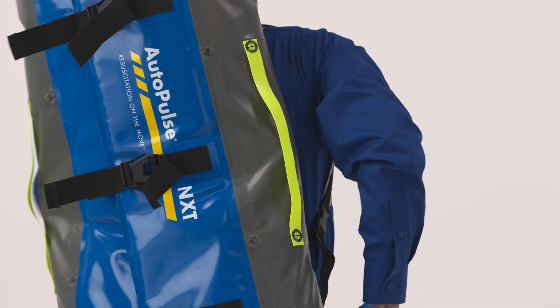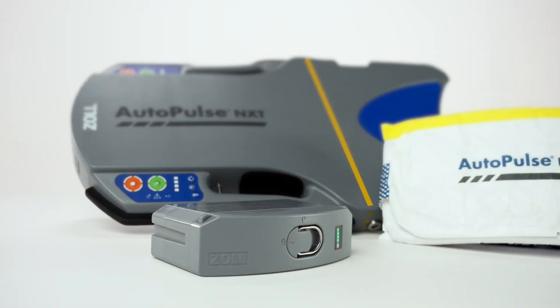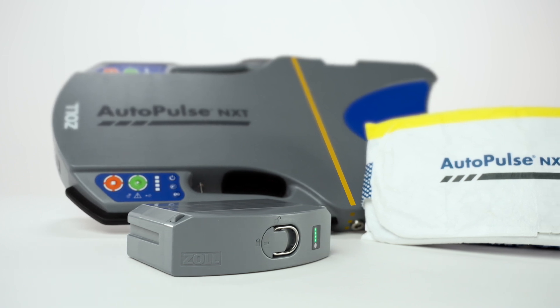AutoPulse NXT is now ready to deploy. We have now reviewed how to prepare the AutoPulse NXT Resuscitation System for EMS deployment.